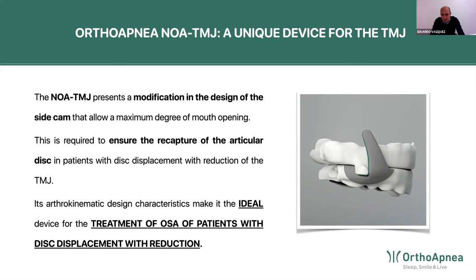In none of those patients has there been a disinsertion of the splints when the patient was opening the mouth during sleep. So there's no worry in this sense. And there is a mouth opening control because of that. Probably not as good as with the regular NOA, but sufficient for the treatment of the sleep apnea problem.